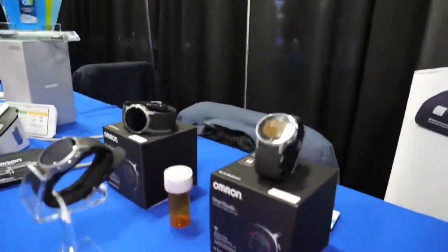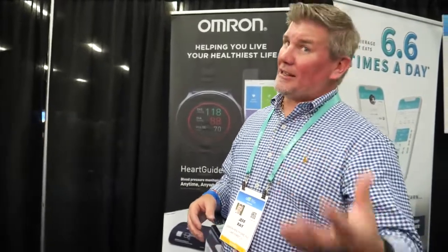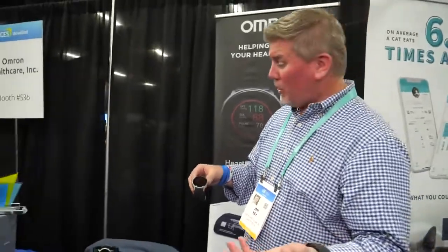The interviewer notes a first video was done four years ago. Jeff explains that's when development started — wearable health technology is now finally reaching the marketplace, and Omron was one of the pioneers. After developing it four years ago, they had to complete lengthy clinical studies and then navigate the FDA clearance process, which also takes a long time. They finally launched it last year at the three-year mark.